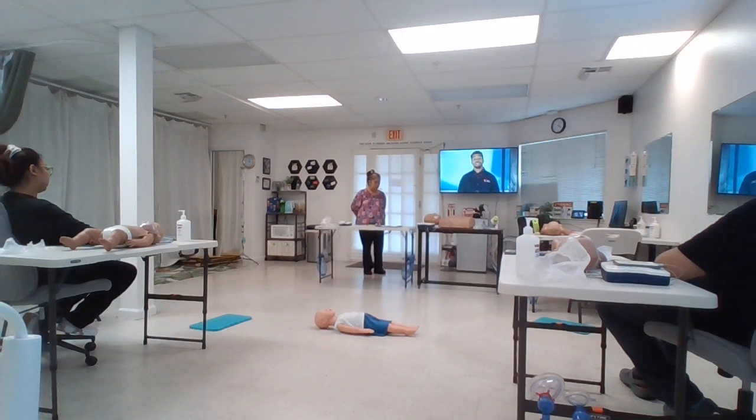Now, let's combine the BLS skills that you've learned for adults with the differences we just reviewed to practice BLS for children. For this session, we'll practice 2 rescuer child CPR by using a 15 to 2 compression to ventilation ratio. One person will provide compressions while the other delivers breaths with a bag mask device.